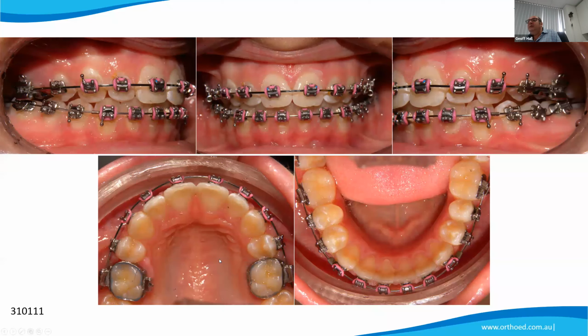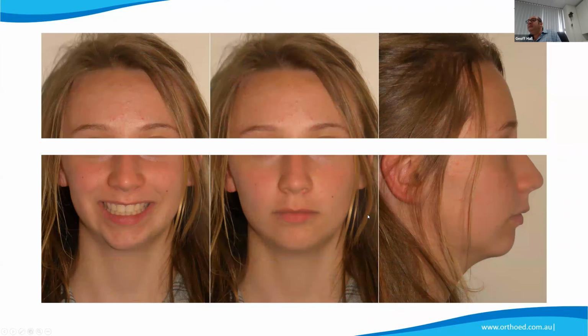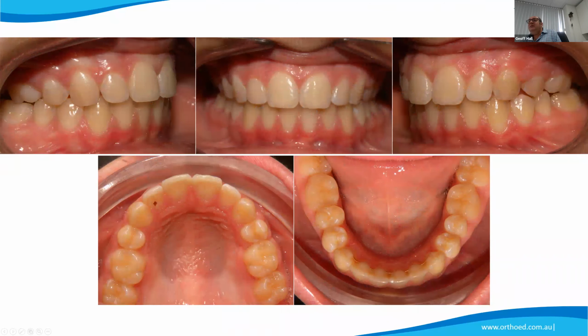Okay. We've got a meeting coming up, mate, so I'm going to have to... Okay, well, we're just about to finish. So just wait one sec. So this is basically our finished result. So just have a look at this. And we've got the lower 5s in place, and they've been stable now for nearly 10 years.